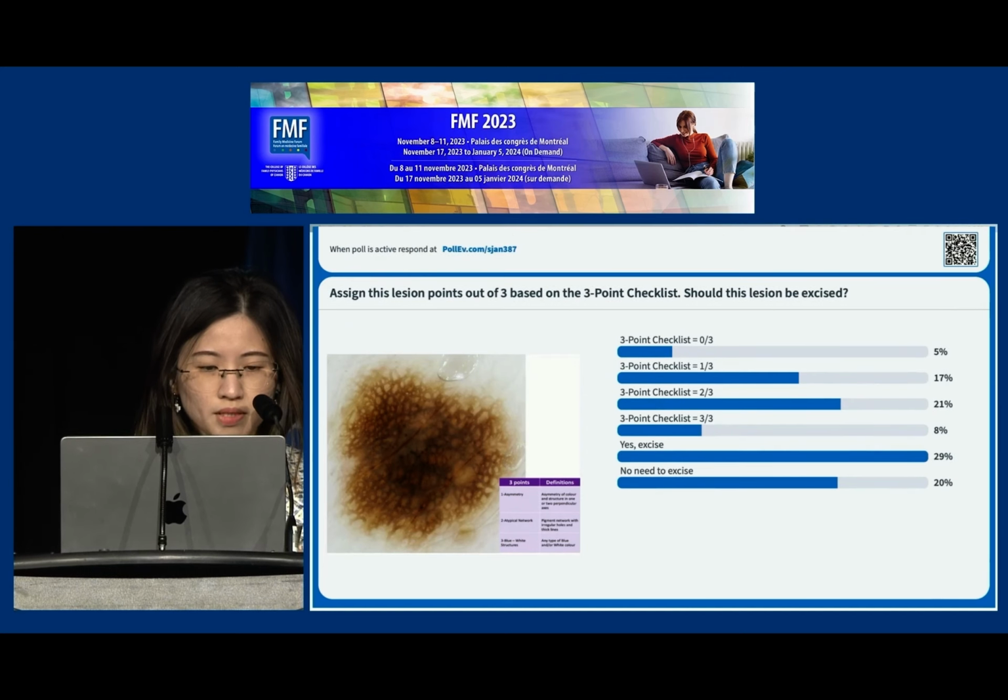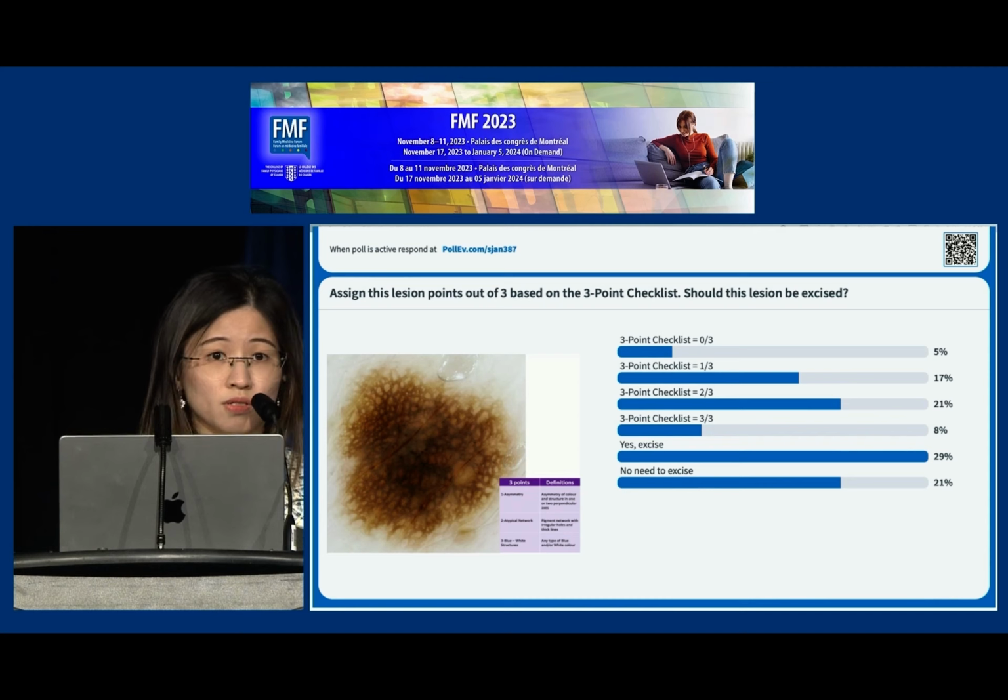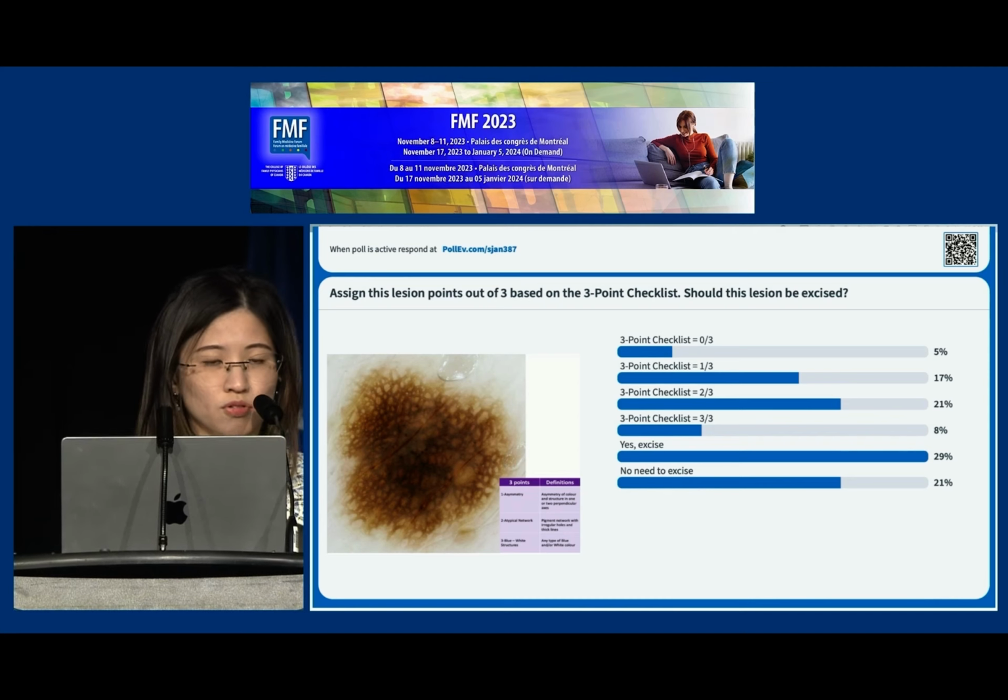That's great. Last case we have here, very thick sort of pigment network, so pretty atypical. It's a little bit of blue-white veil, right? It's almost like someone put a layer of lace or something like that on the top and gives you that sort of opaque look. And pretty symmetrical, but either way it meets 2 points. So this is the beauty of the point system, right? If it already meets 2 out of 3, you know it's coming out. It actually came back as a melanoma.